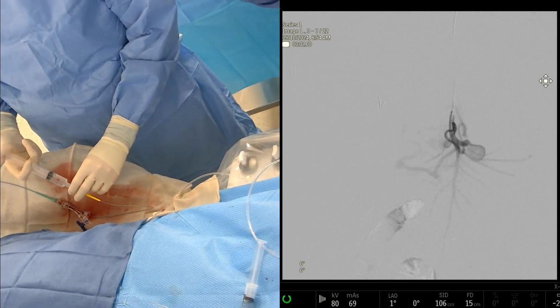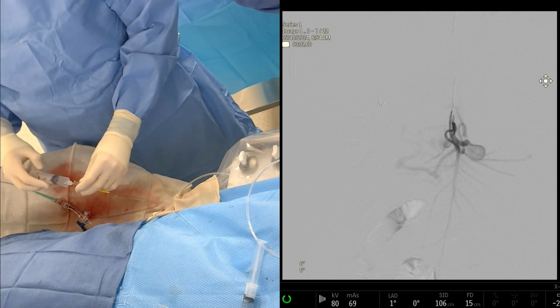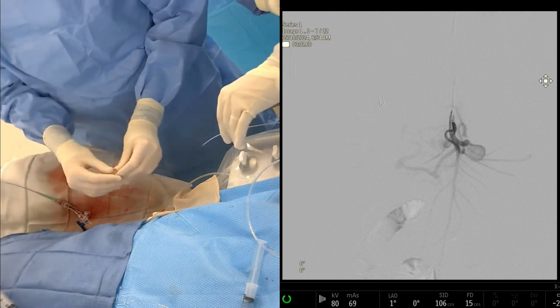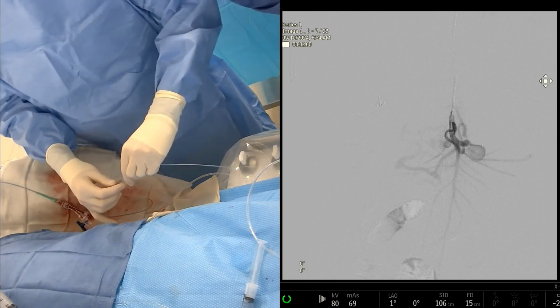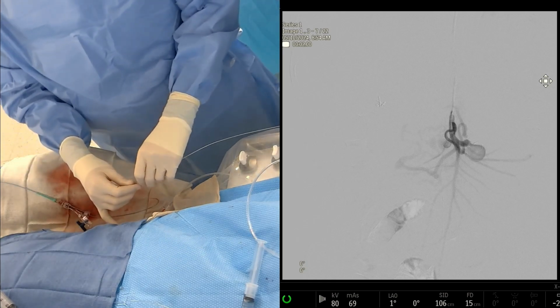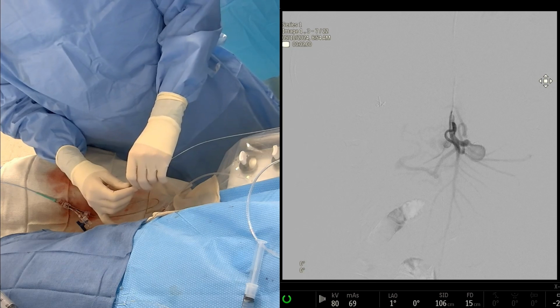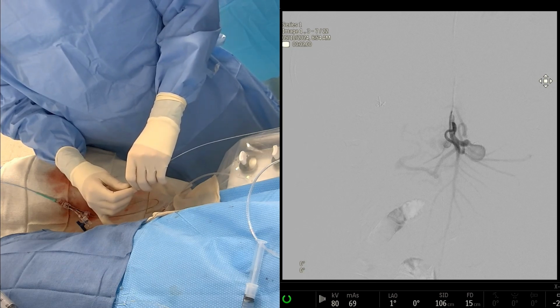It's basically that first branch going to the left, right? So it's not a ton of space before we get into the SMA. The advantage of a guide cath system here, though not necessary, is that you can repeat an angio with your microcatheter in place to see exactly how much running room you have. Yeah, I think right here that would be the difference.